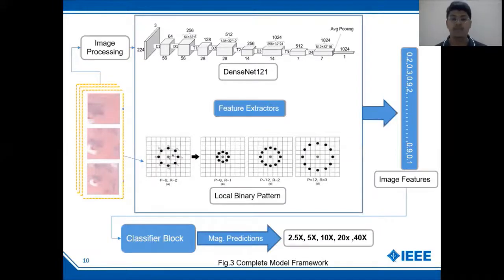An entire framework is seen in this diagram, and we see that the image patches are being pre-processed. By pre-processing, we normalize the mean and standard deviation, and we pass the images through the network, without changing its weights, to extract the features. Using this, an image of 800 pixels by 800 pixels becomes a feature vector representing an array of length 1024, that is 1024.